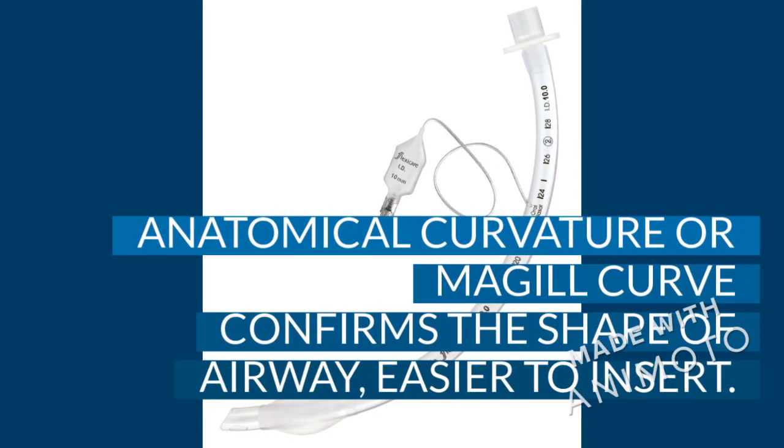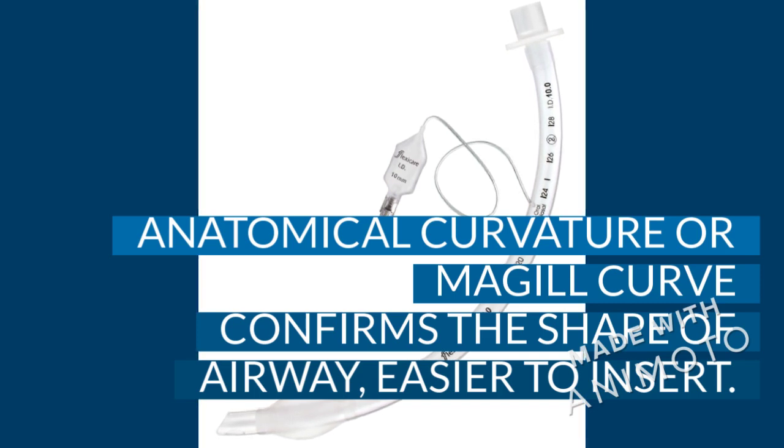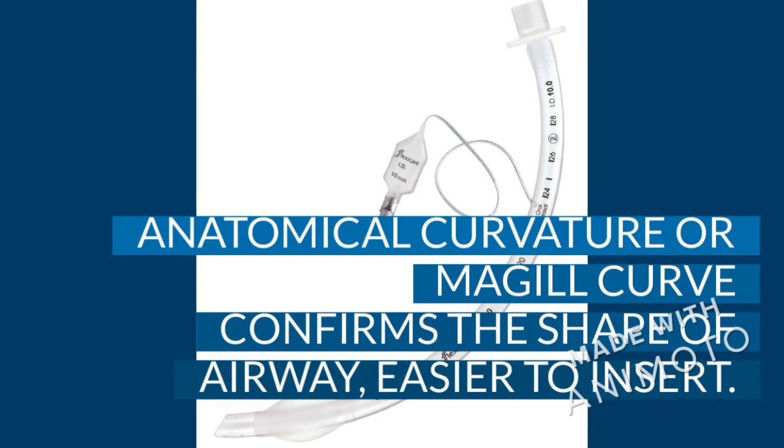The ET tube has its own curve, also known as the anatomical curvature or the Magill curve. What it does is it conforms to the shape of the airway, and it is also easier to insert than a straight tube. It's usually 140 radius.